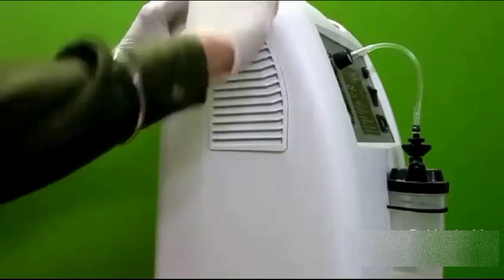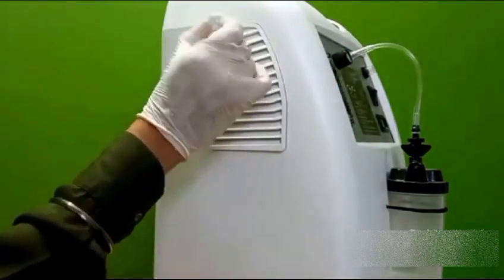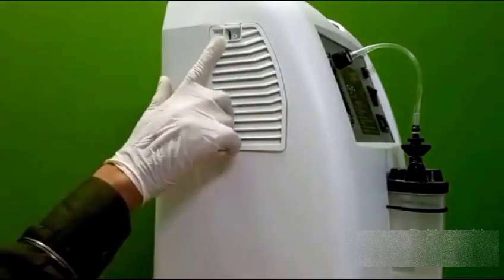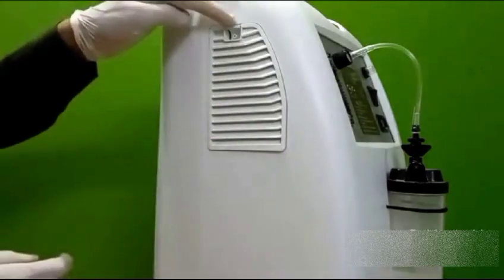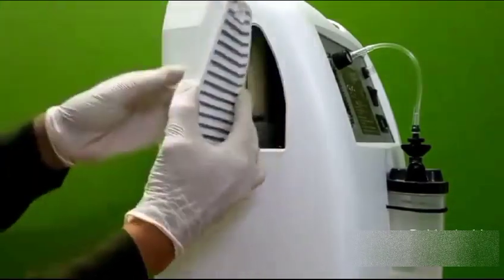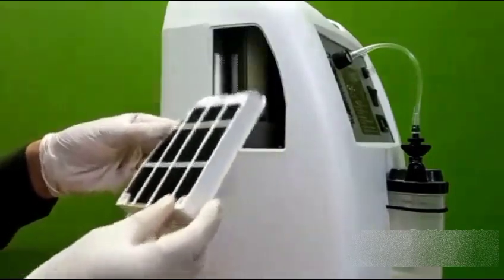After unscrewing, there will be a plastic lock on top. You press it and remove it. Here you'll see this is a plastic lock. Remove the lock. After removing it, press the pipe from the top. The bottom one stands, and this cover is going out from the side. On this cover you will see this black color that you are seeing is its filter.